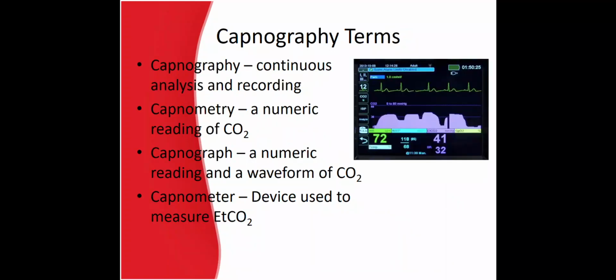So let's review some capnographic terminology. Capnography is the continuous analysis and recording. Capnometry is a numeric reading of CO2. A capnograph is a numeric reading and a waveform of CO2. And a capnometer is a device used to measure end-tidal CO2.